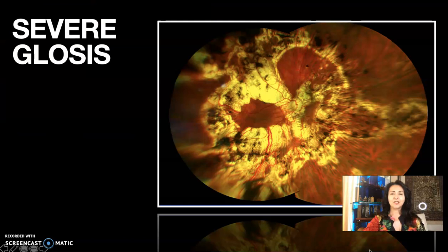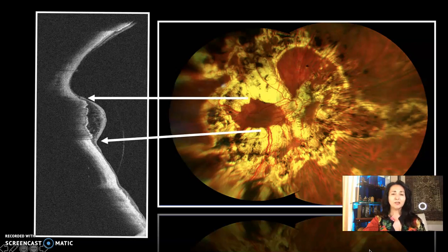This is a 50-year-old male with a severe myopia and extreme atrophy. He was operated by me for retinal detachment, and 1 year later he developed this bad gliosis. He was desperate. I've been waiting because I didn't want to operate, but then vision went down and down, and I had to remove that gliosis.